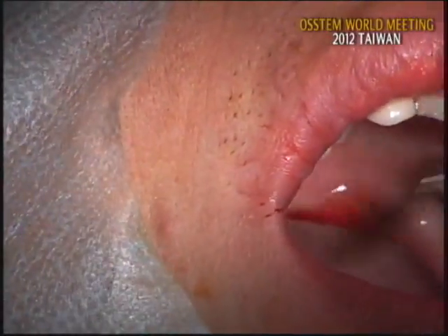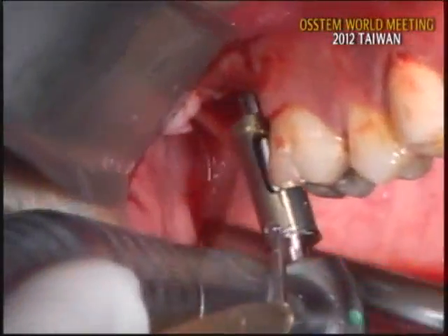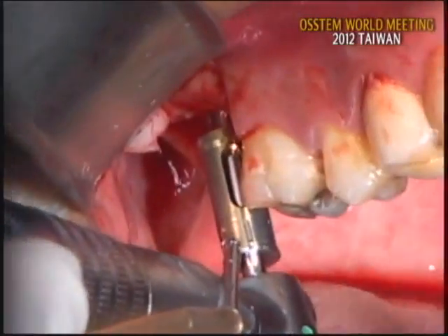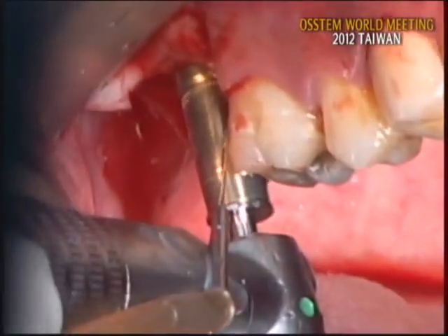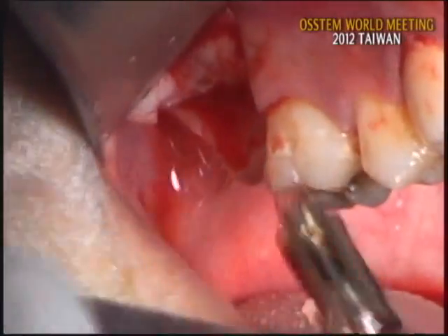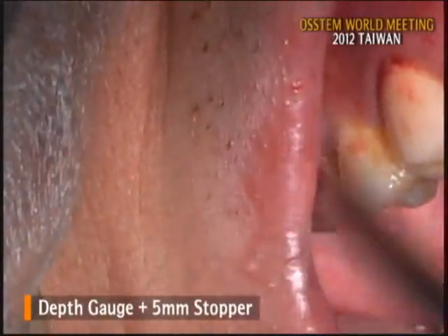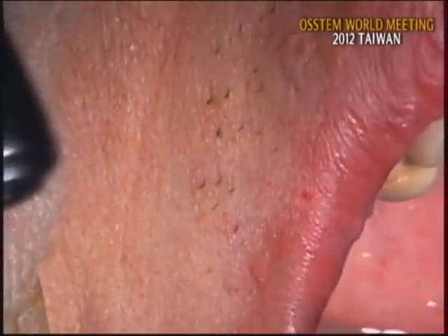This step just enlarges the hole. I don't advance the drill, I just enlarge the hole. With the same speed, I enlarge the hole to 3.3 millimeters. Maybe it has not passed yet. Then I will advance the drill.